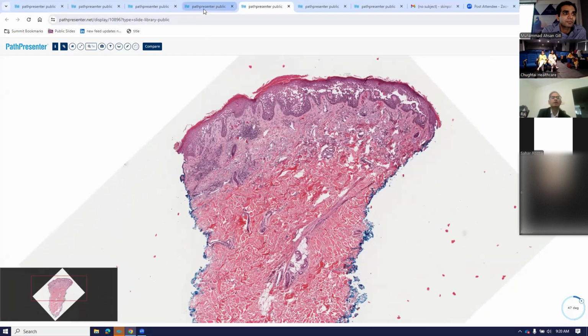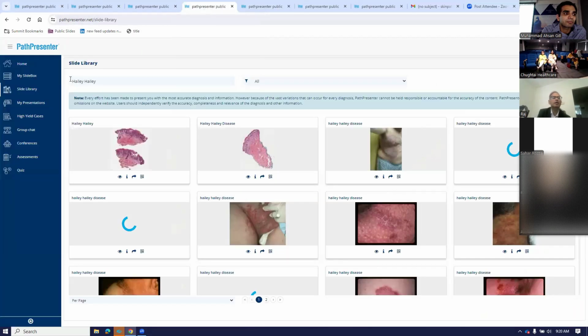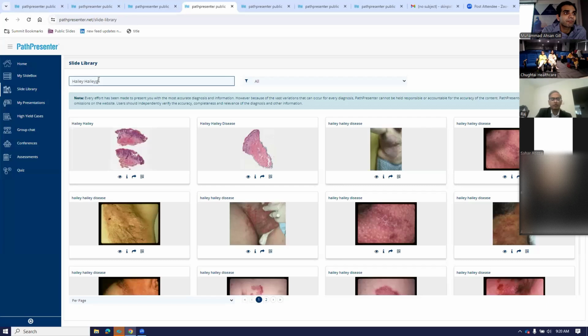And Grover's and Darier can look very similar. Let's open up a Grover's.